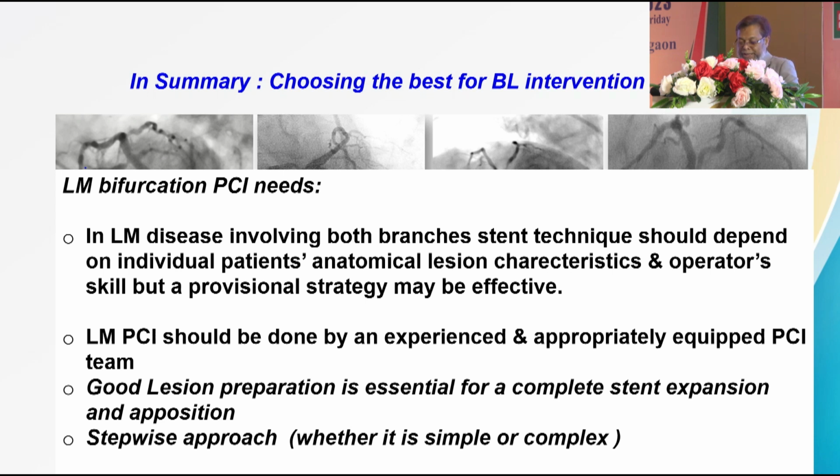LM PCI should be done by an experienced and appropriately equipped PCI team, and good lesion preparation is a must, and a stepwise approach is also superior.